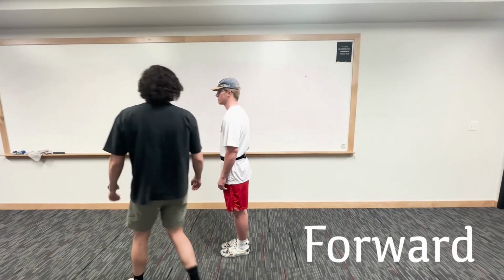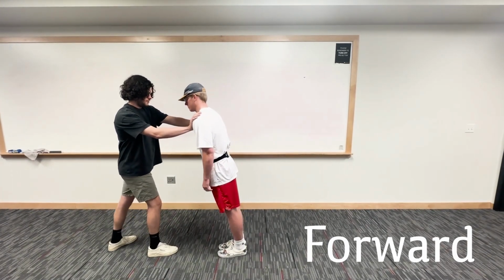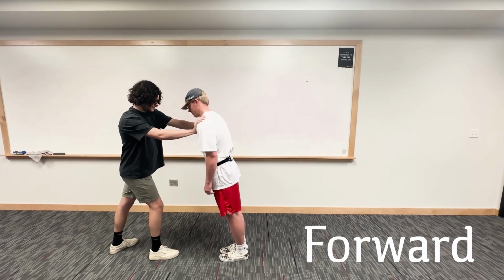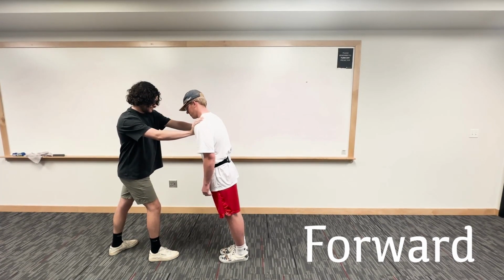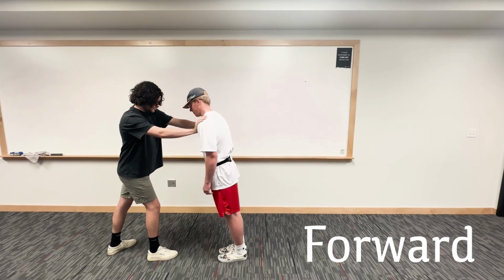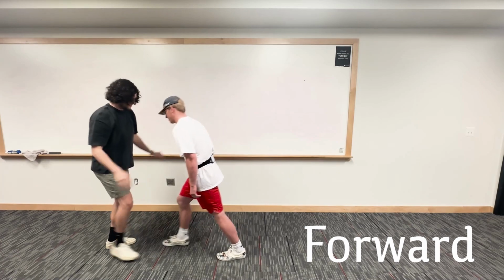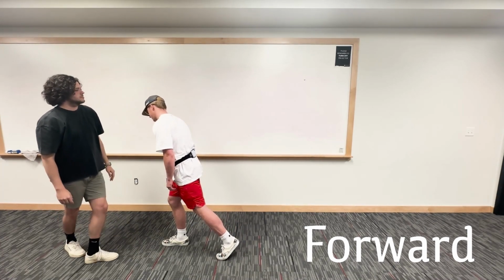Once the clinician presses start, they will get ready to hold the patient and bring them to the right angle. When the patient is at the right angle, a chime will play. It can be tricky to find the right angle, and we find that clinicians we work with are much better at doing it than we are. Once the patient regains their stability, the app automatically goes to the next page.